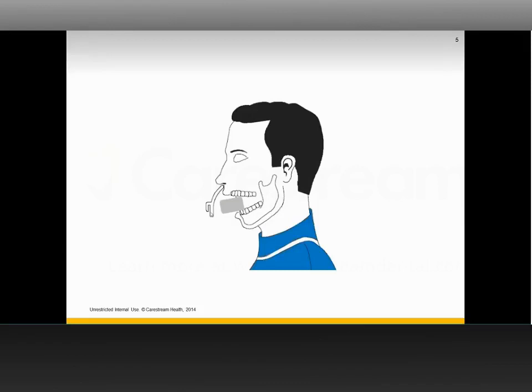Excellent. And as can be visualized here, we've got the bite block in. We show the specific control that is here for a TMJ. What's not visualized is the temple clamps, and the possibility to add a head strap if necessary. And of course, as with all of our cone beam CT, the patient can be sitting or standing.